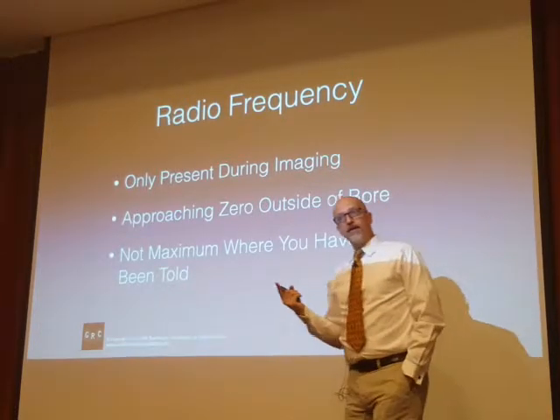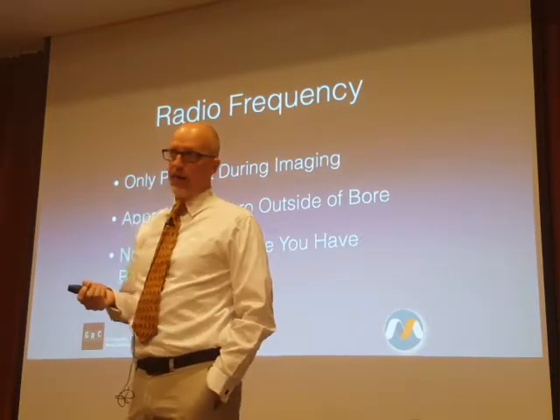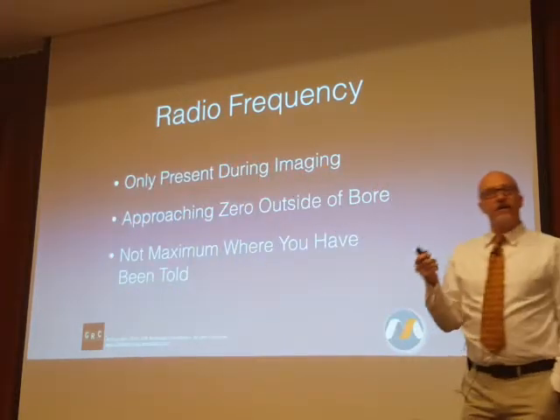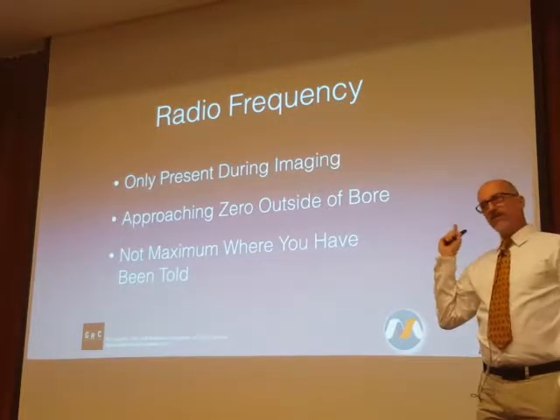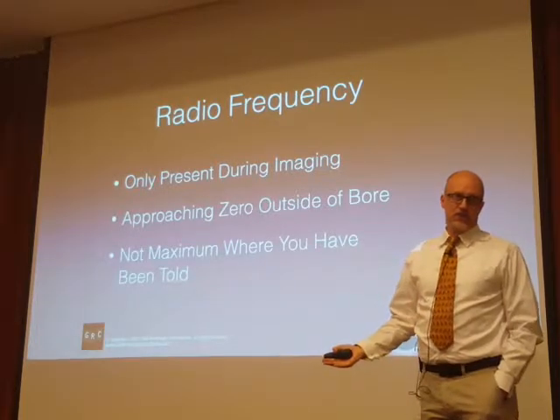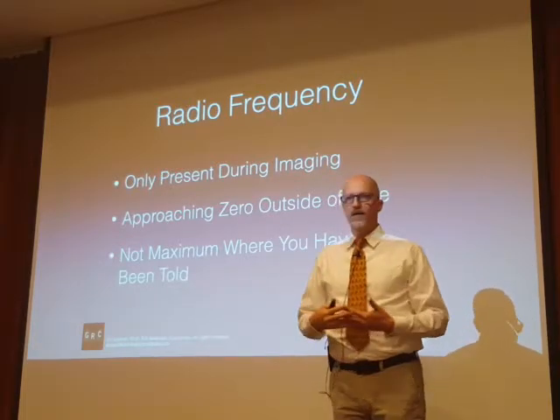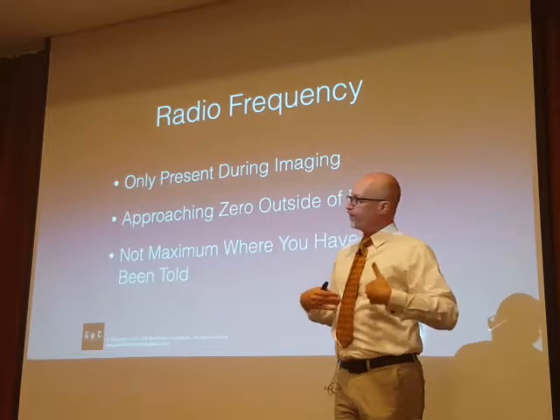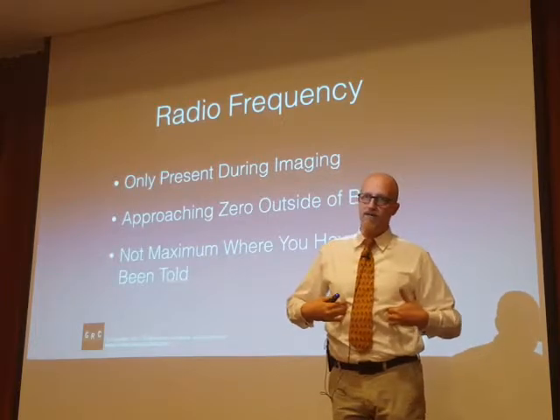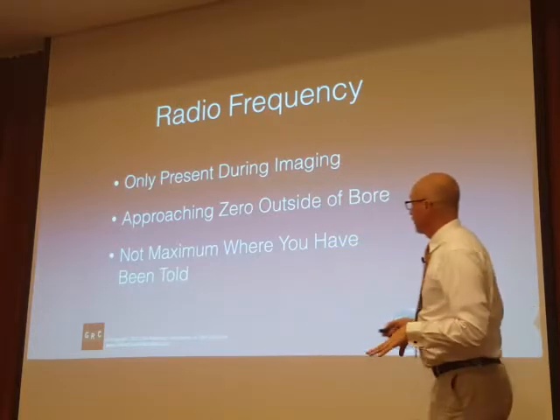Radio frequency, like time varying gradients, is only present during image acquisition. If we're not acquiring the image, there is no radio frequency energy present. Radio frequency energy also, like time varying gradients, if we're outside the bore, the exposure is approaching 0. If you're standing even at the mouth of the bore, outside the magnet, and the sequence is running, the amount of radio frequency energy that the patient gets, or pardon me, that a subject gets standing outside the bore is almost nothing. Radio frequency energy dies fairly quickly.